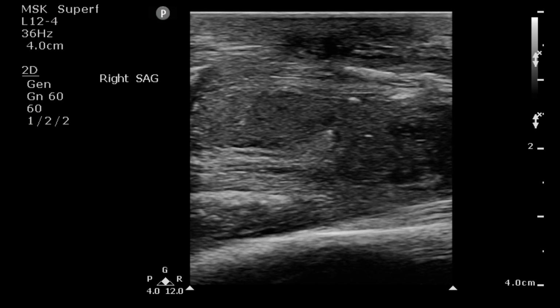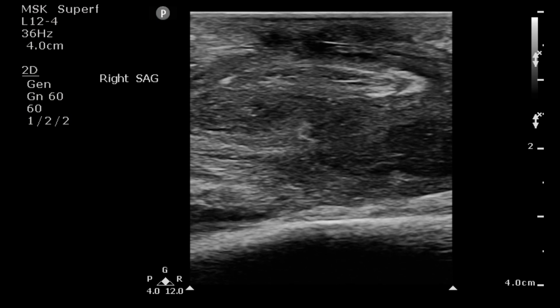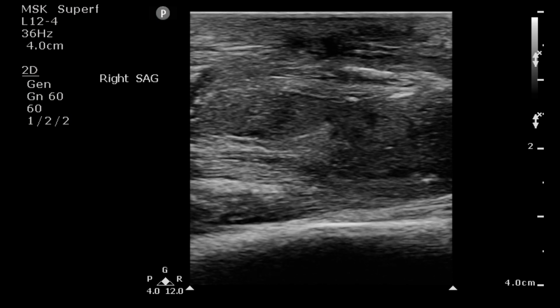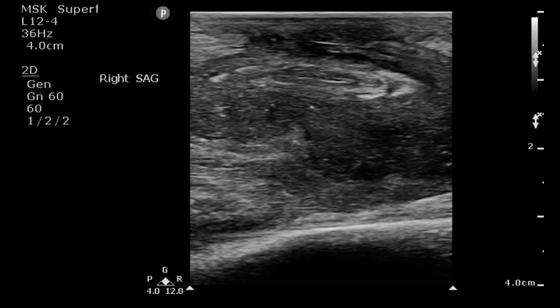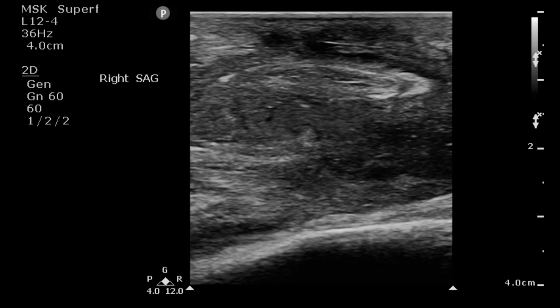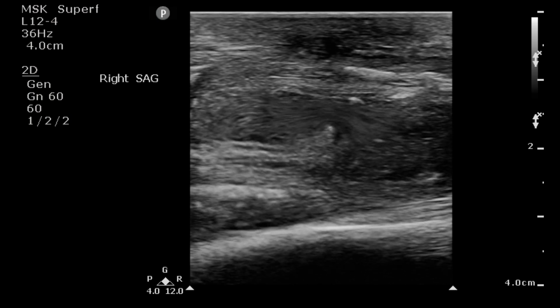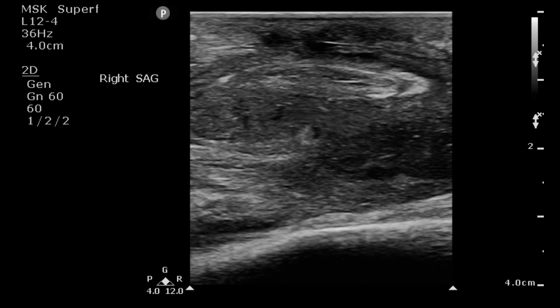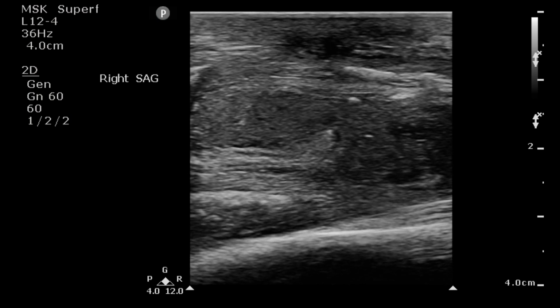And so I've definitely utilized this principle over the years in my practice where I haven't maybe initially got purulence, but I know that where I made the incision is deep and just off to the left, right? And so I begin dissecting down in my incision deep into the left, and lo and behold, I get it, right? Or, hey, I expect this thing to be a pretty simple one, but wow, this really goes a lot deeper than I expected. Or the counter, like, man, I wonder how deep this goes. Oh, it's just one little pocket. If I just open that, express the purulent fluid, I'm done, right?